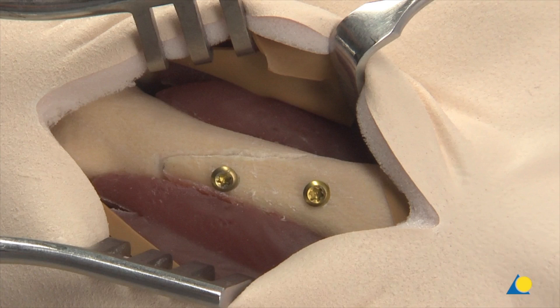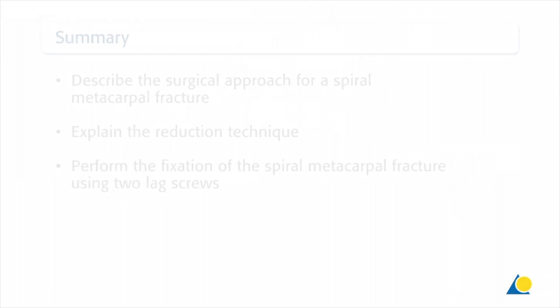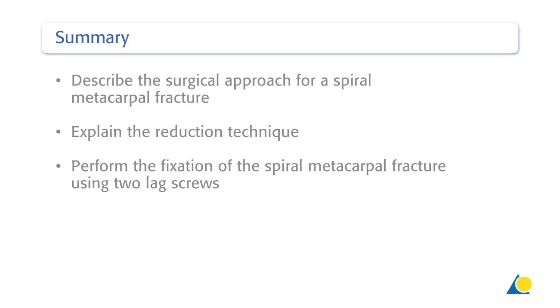The reduction forceps is removed. Alternating between the two screws, they are now tightened completely. This completes the reduction. The fixation is now stable enough for light exercise. You should now be able to describe the surgical approach for a spiral metacarpal fracture, explain the reduction technique, and perform the fixation of the spiral metacarpal fracture using two lag screws.